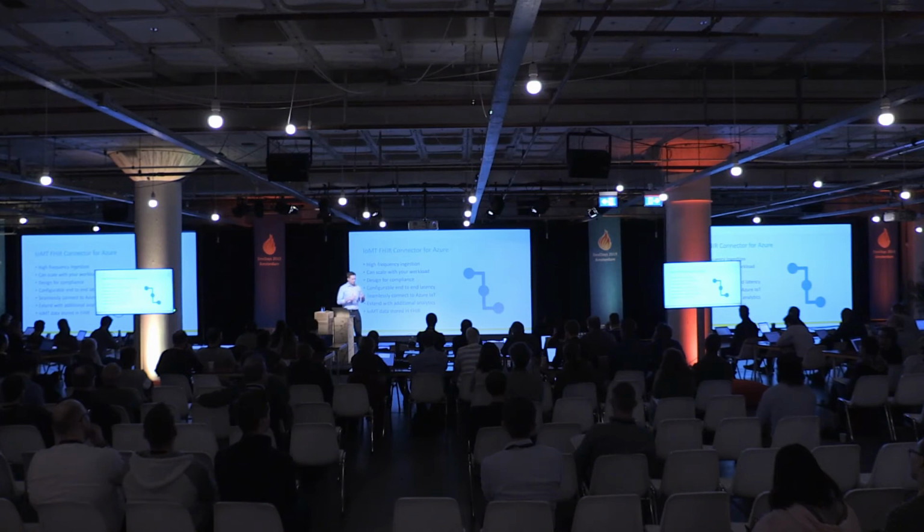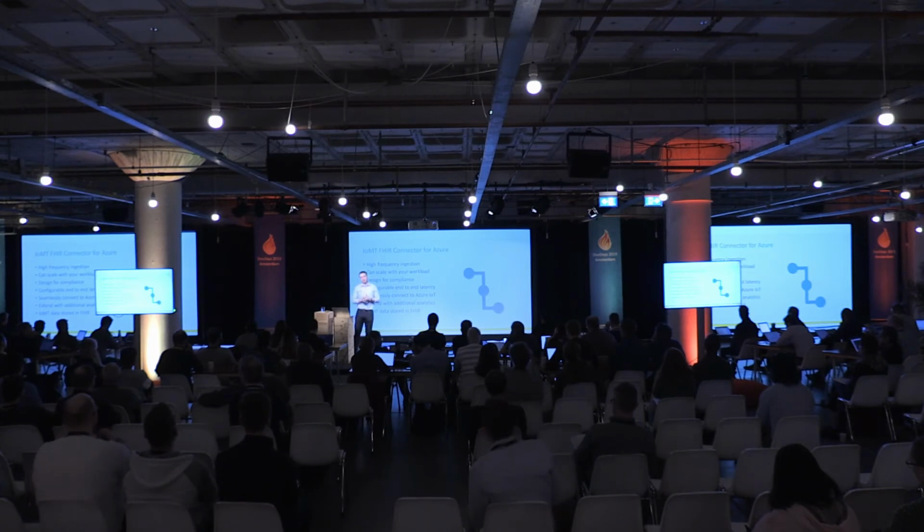And a couple more bullet points. The end-to-end latency is configurable by you, so you have direct control over essentially the buffer time between when data is ingressed and when it gets flushed out to your FHIR server. So you can have something, say, 30 seconds, 5 minutes, or an hour. It's really up to you and your particular use case. So you can control that balance.